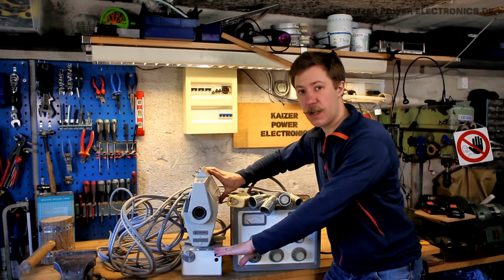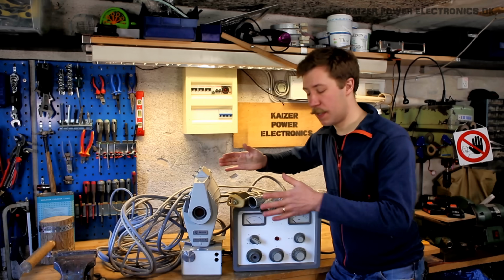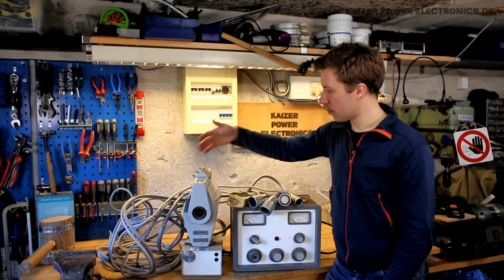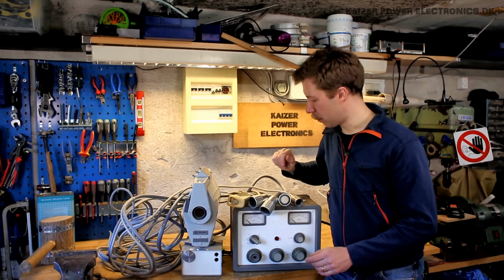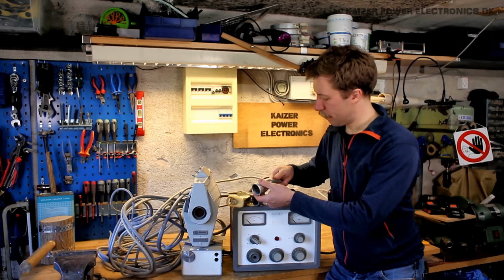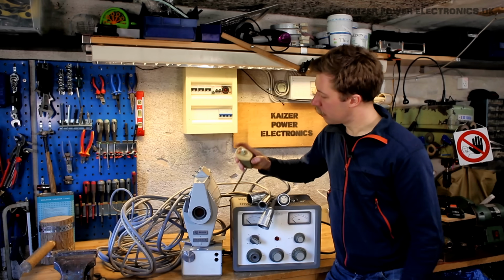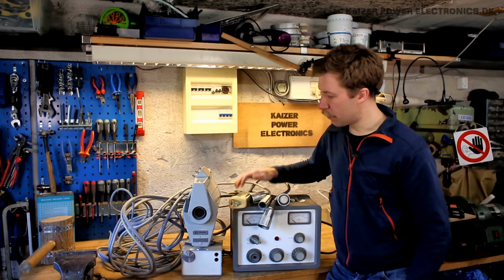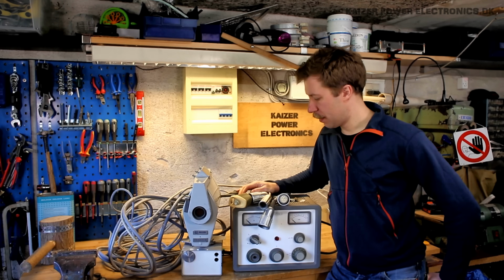At the bottom we have the collimator which shapes the beam, and all the inserts of aluminum plates and such. Along is also the complete cable set, so we have some nice big old school aluminum connectors here. Trigger button, double actuated. Some very nice old school stuff.